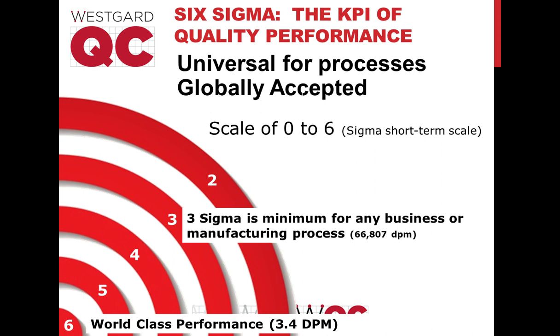That's a good question, and it brings to mind the difference between a bundled control and a manufacturer's control. As we noted earlier, the guidelines and the regulations are encouraging labs to use independent or third-party controls. A manufacturer's control is one where the control itself has been somehow affected by the manufacturer, whereas with an independent control, the manufacturer hasn't had a chance to make any adjustments.